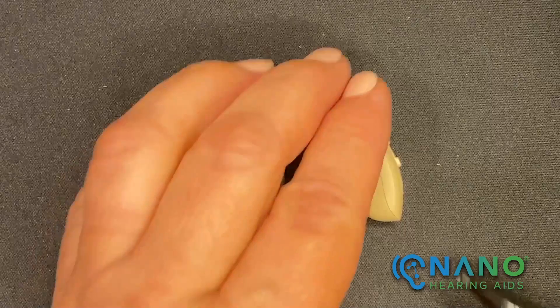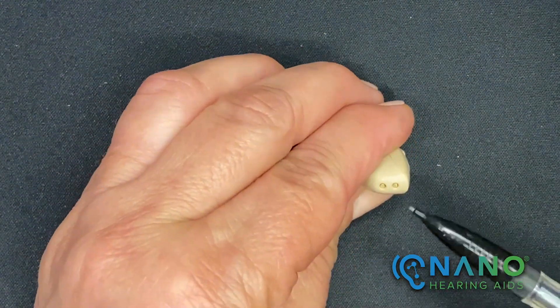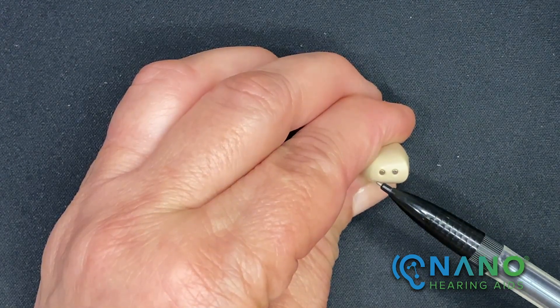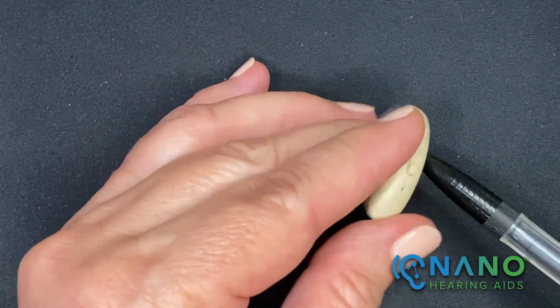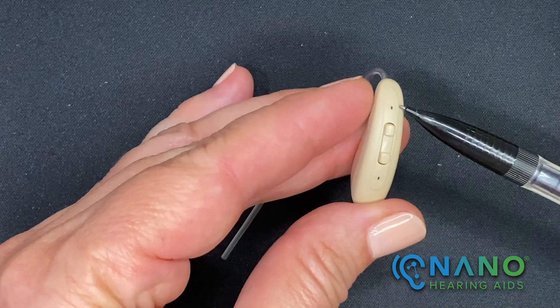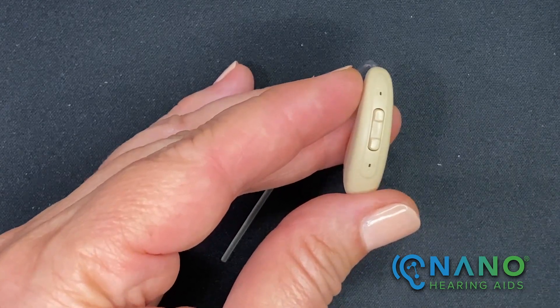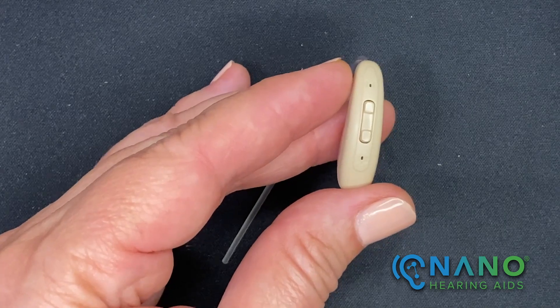On the bottom of the hearing aid you'll find the charging contacts. The microphones are located here, and we want to be sure they're always free from wax and debris.